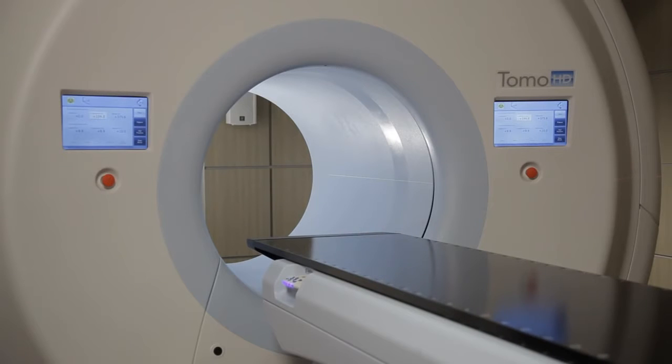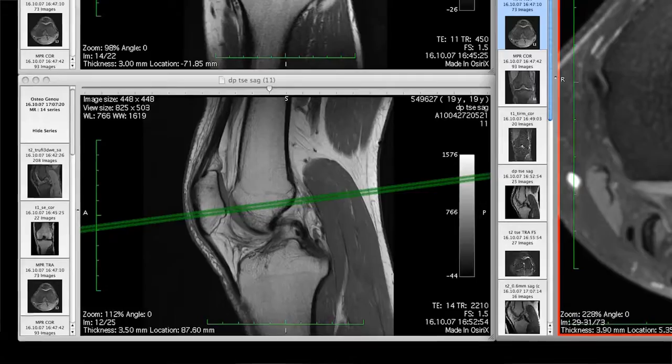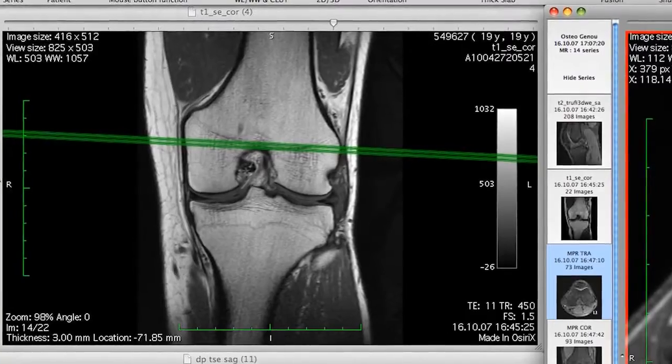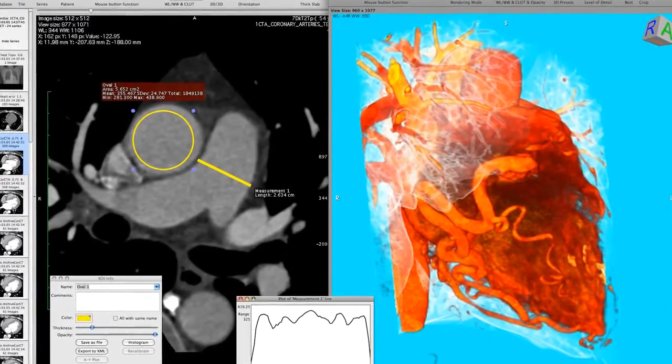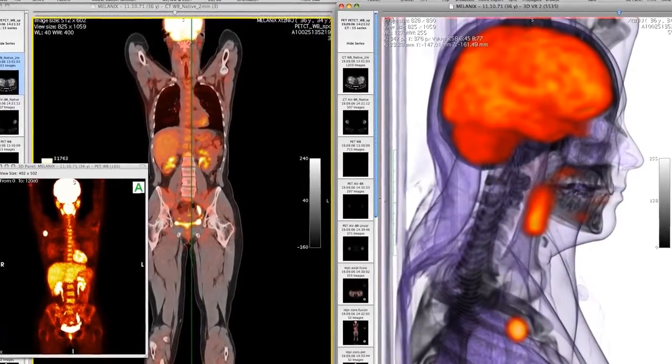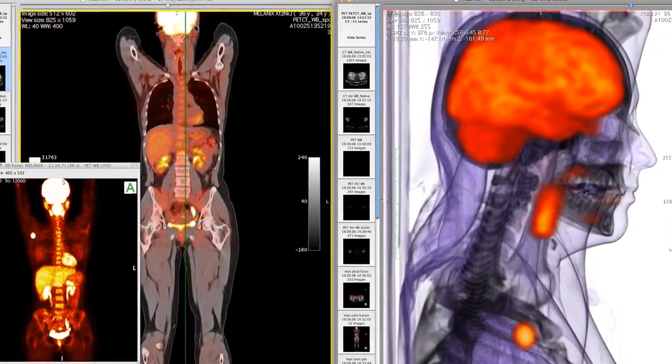The CT scan, if you've ever been in one, they look very much like the tomotherapy unit, very similar. A CT scan works by delivering several slices of X-rays from all different angles. That's all it is, all these different angles. And it comes back and creates this volumetric pattern of you, this image. So what you end up with after a CT scan is a three-dimensional model of you. So that's one of the first things that happens when you come in to get radiation treatment nowadays.